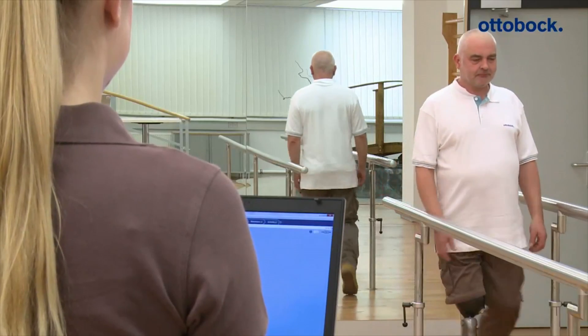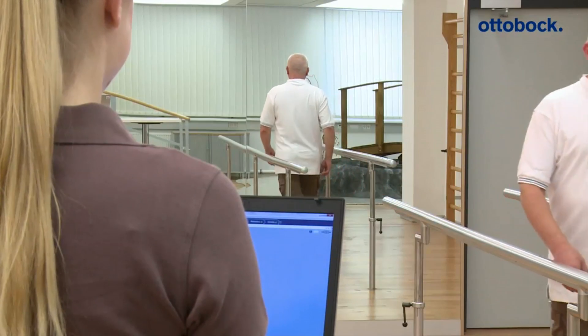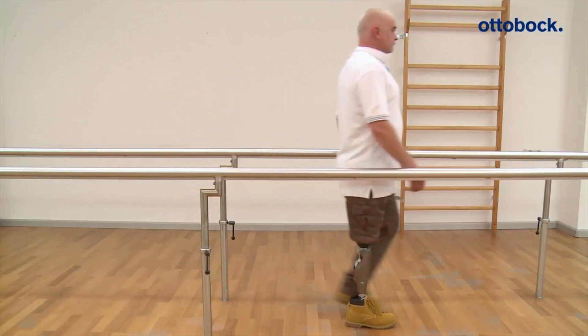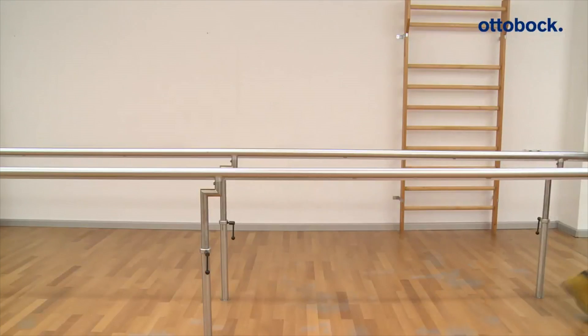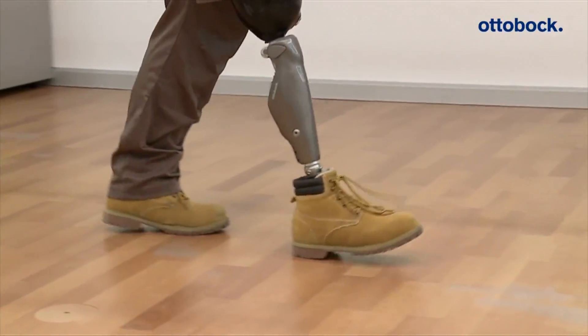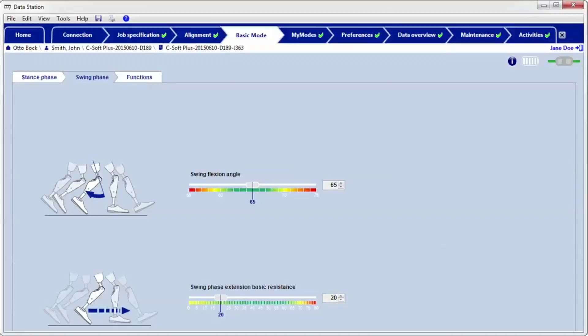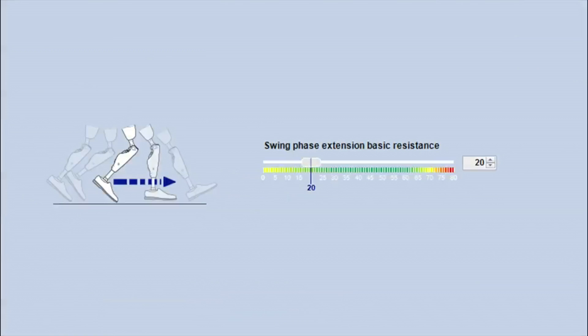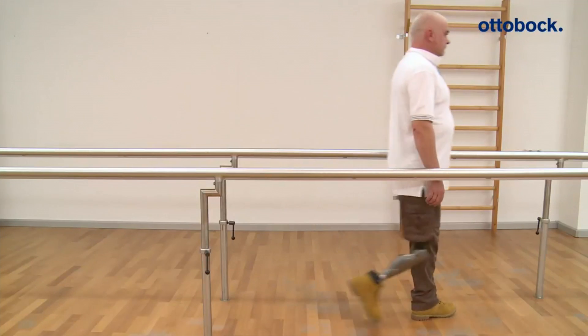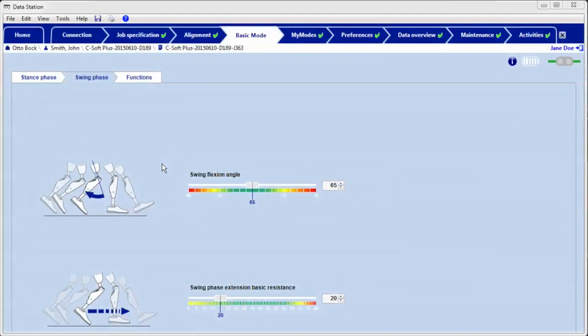The swing phase extension basic resistance acts during slow walking on level ground. This parameter describes the resistance acting during the beginning of swing phase extension and determines the extension speed, and therefore also the duration of the extension movement. The standard value in the adjustment software is preset to 20 and can be adjusted individually for each patient. The orthopedic technician checks the swing phase extension basic resistance during slow walking on level ground.